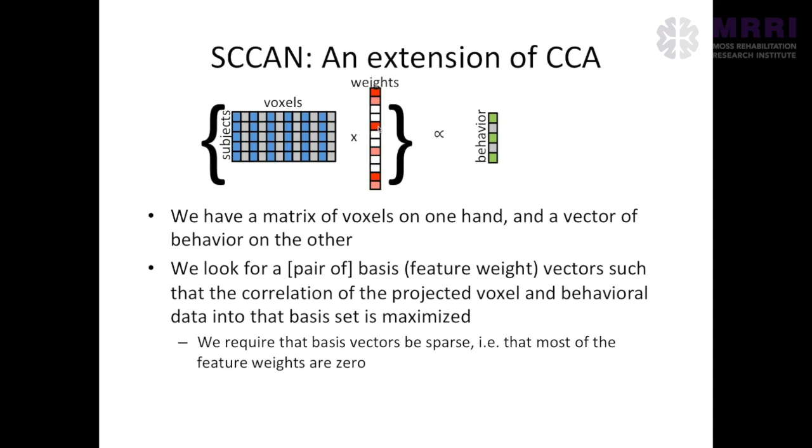So what we're going to do is find all the voxels that cluster where the cluster size is less than some threshold, and set all those back to 0. Okay. So we have inherently built into this method a cluster size threshold, which is applied as you're calculating the weights.